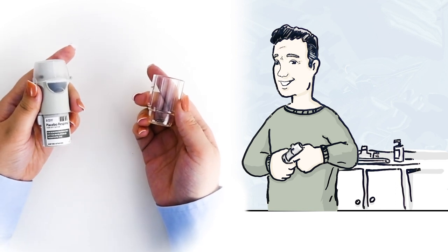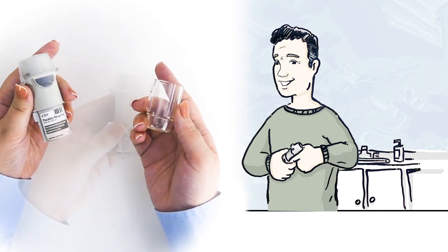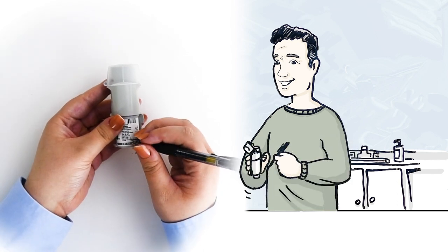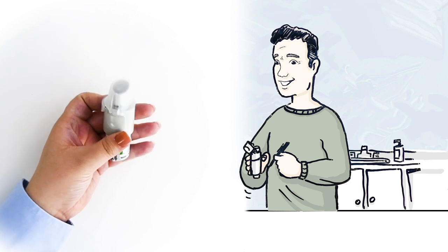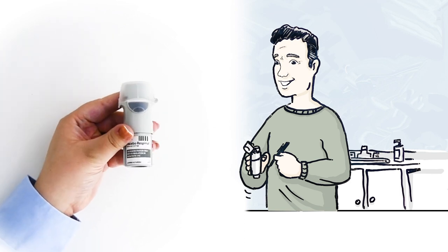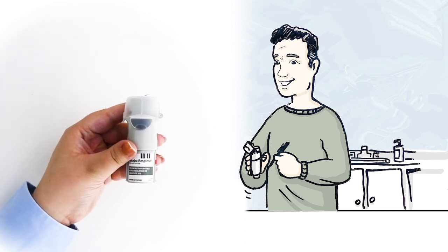I point out the piercing element and remind Henry to be careful not to touch it. Next, we write the discard by date on the label. Once the medicine is put into the inhaler, it is good for three months. So, the discard date is three months from today's date.